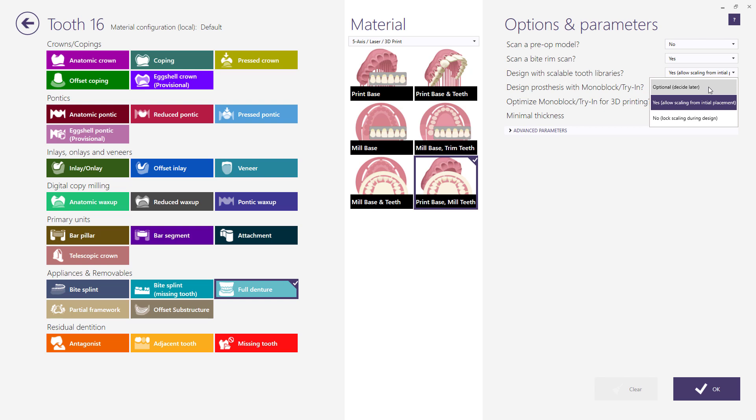Additionally, the selection optional decide later is available but not set by default to any specific material.